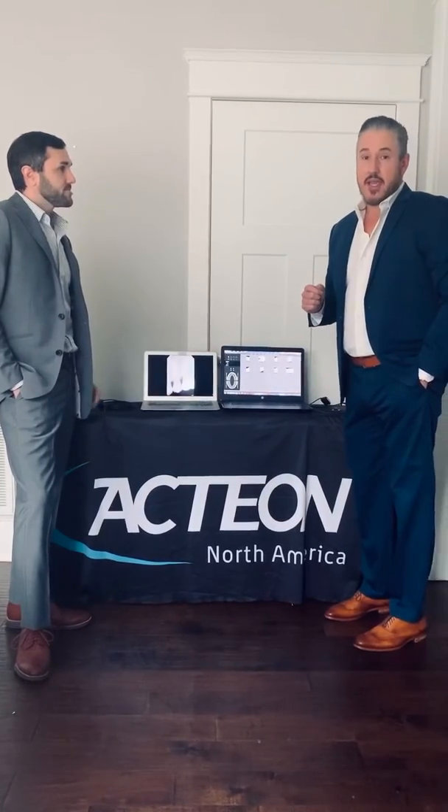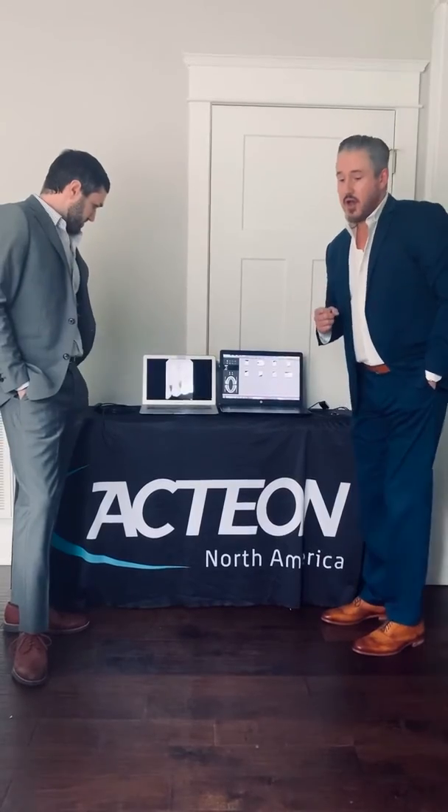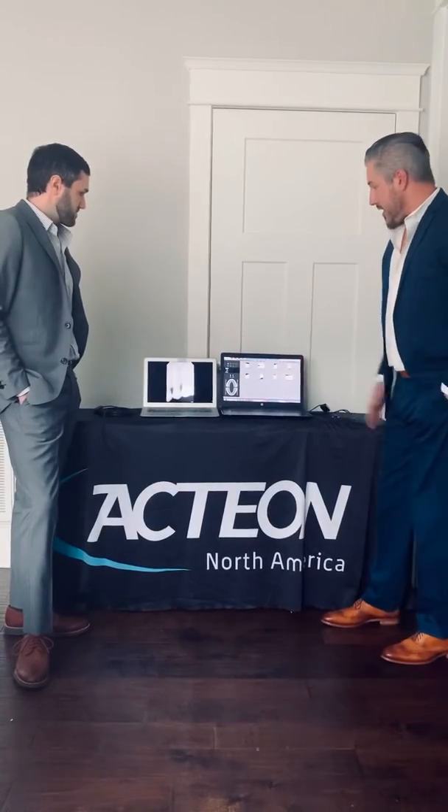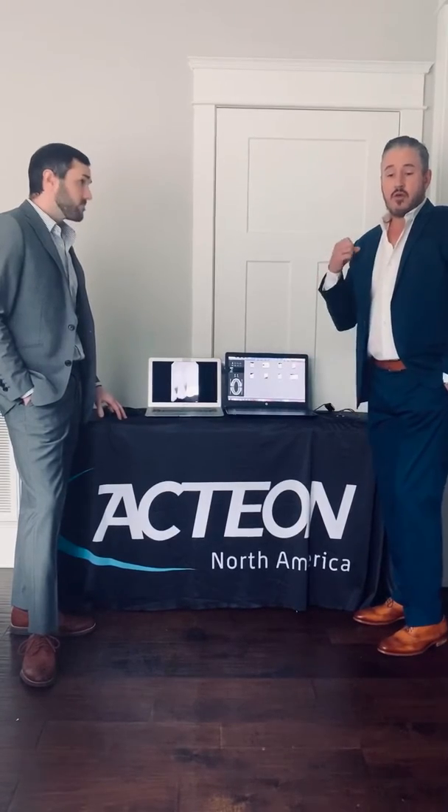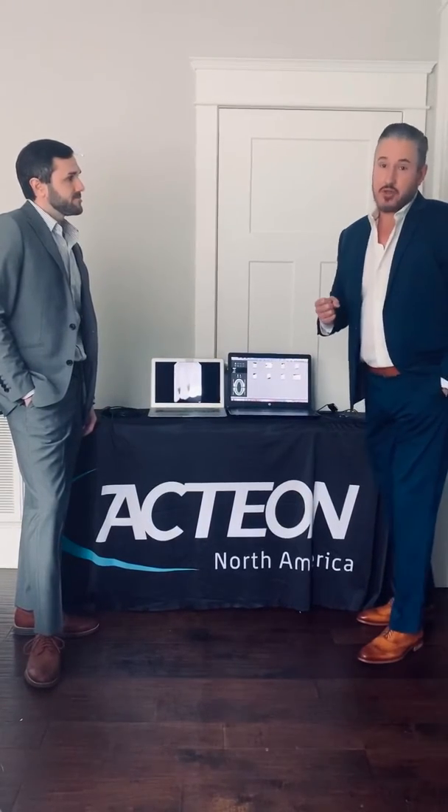We're using the latest technology in our sensors. As you can see here, we've got Mac and Windows — we're Mac and Windows compatible. We're also compatible with all your major softwares out there. If you have any particular questions on software integration, you can reach out to your local Acteon rep. One of the major things that we do is we will give you free complimentary software with a purchase of our sensor.